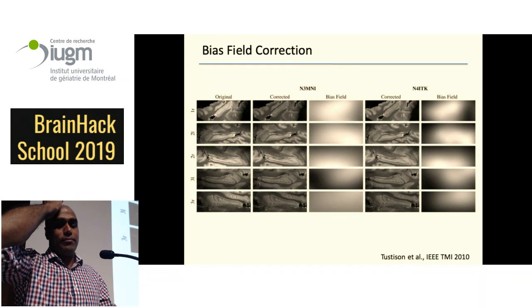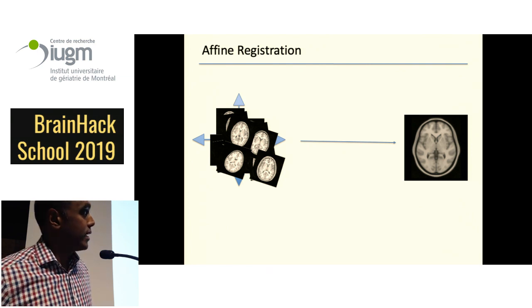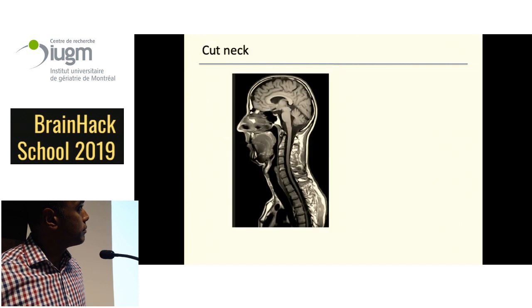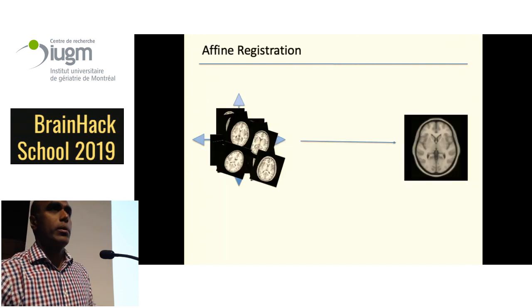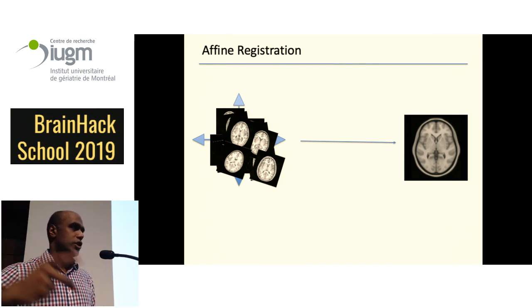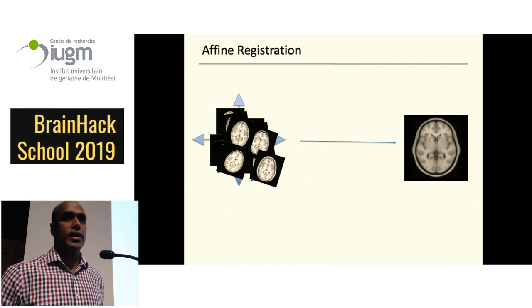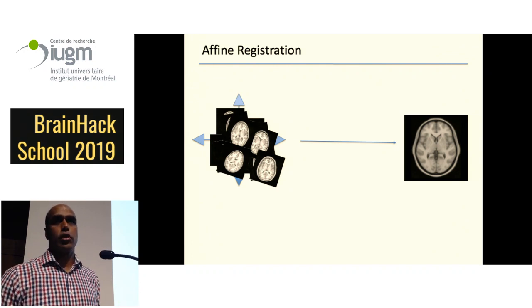So yeah, then there are other steps related to affine registration. What that does is it aligns each image into MNI space. It's supposed to be an animation here, which is not happening. But basically, it would align each image based on translation, three dimensions of rotation, overall scale, and the shear property into MNI space, right? That's called a linear transformation, which is fully invertible, and you can go back to your original image if you need to.